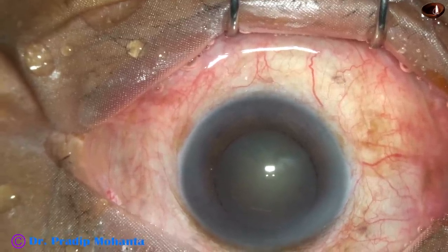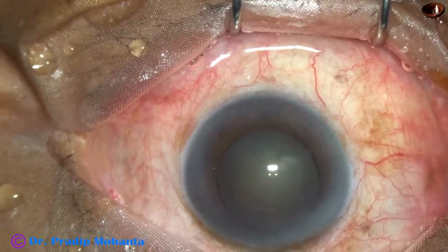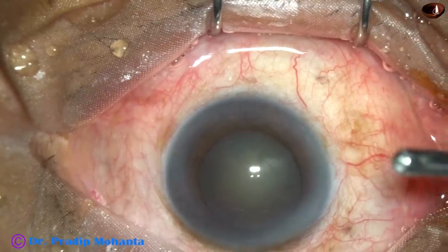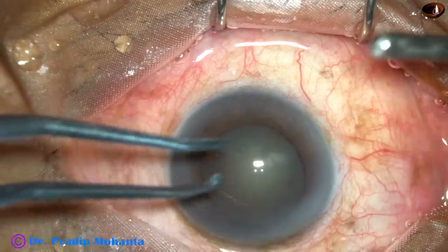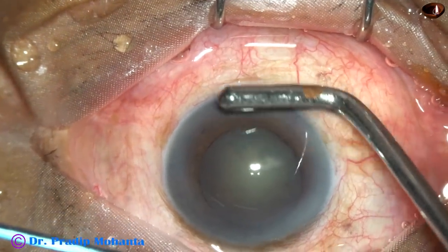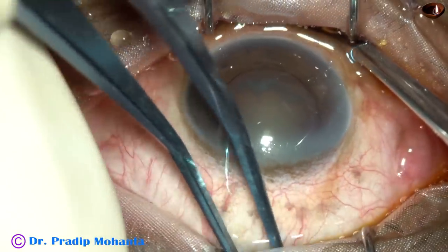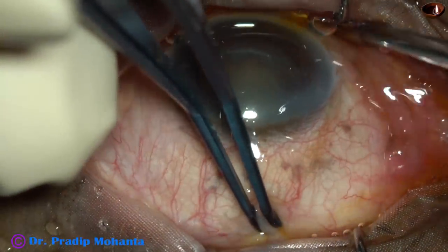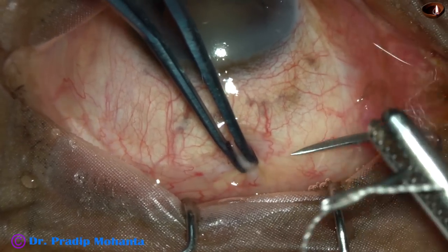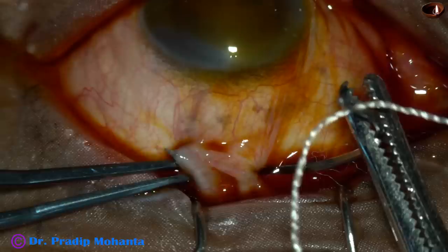First, take a muscle hook in your right hand and the superior rectus holding forceps in your left hand. Place the muscle hook in the inferior fornix and press — the eyeball turns a little down. Now pinch the superior rectus tendon and apply the superior rectus bridal suture.